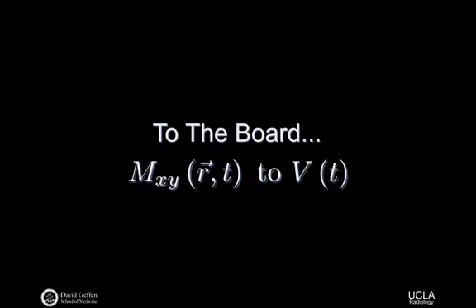And then we have two terms that will come out of the partial there, right? Or two sort of big terms that will come out. So the first term will deal with the exponential, for example. We have minus 1 over T2. T2 itself can be a function of space, right? It's not uniform in the subject, in the object. So that's times e to the minus t over T2 as a function of space. And that's multiplied onto our cosine term. Cosine of minus omega as a function of space times time plus the phase from the RF field, which may be a function of space. That's the first term.